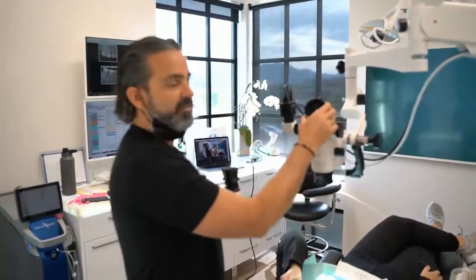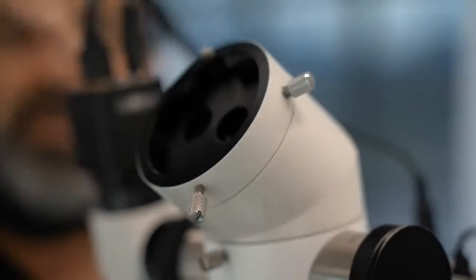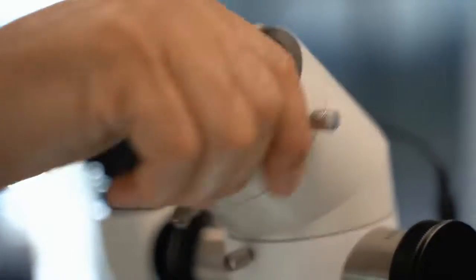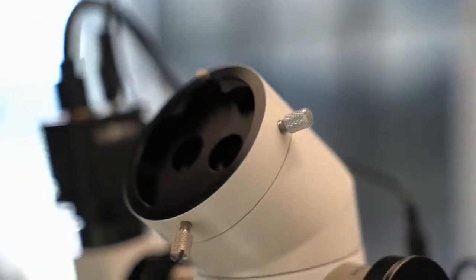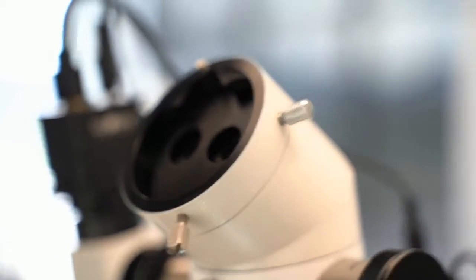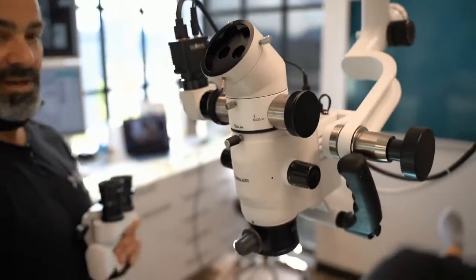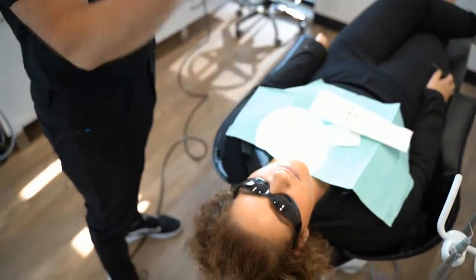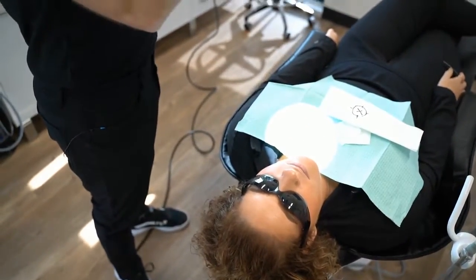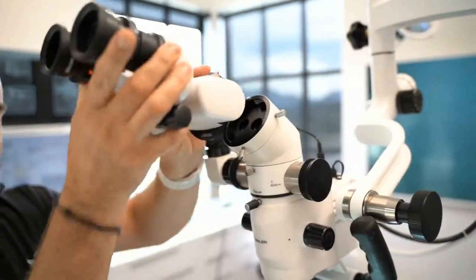So this little piece right here is where you get your correction of your cant of your eyes. So if I have it at an off axis, this is a little extender piece. And because I work at 12 o'clock over the head, this angle that's up here extends my eyepiece over her head.